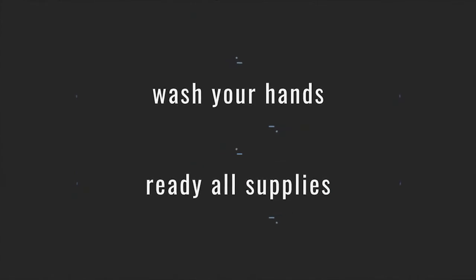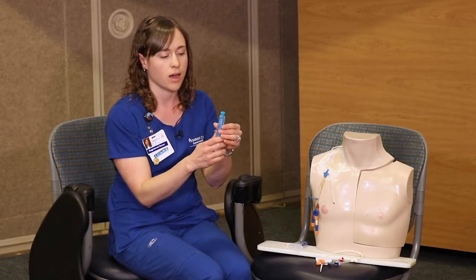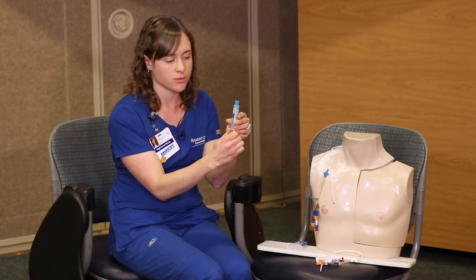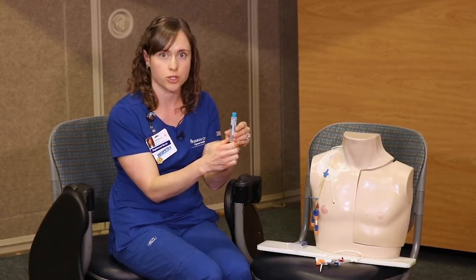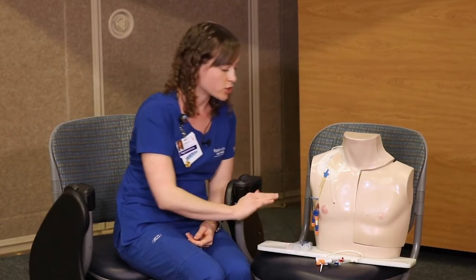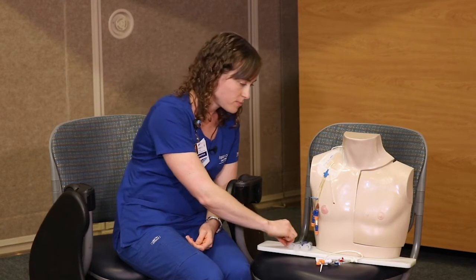These flushes come in a wrapper, so take them out of the wrapper. There's a little bit of an air pocket in here — if you pull back on the bottom of the syringe, it releases some of the pressure and makes it easier to flush once hooked up to the line. Have all three heparin flushes laid out, along with your swab caps and the chlorhexidine cleaner.